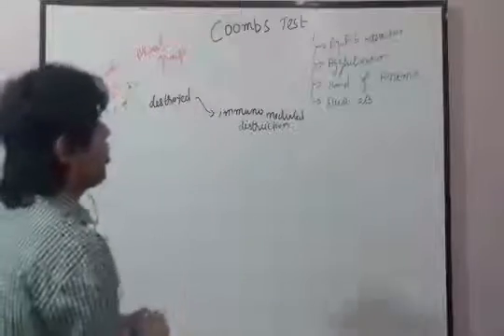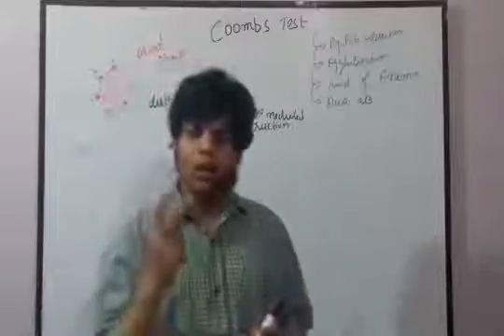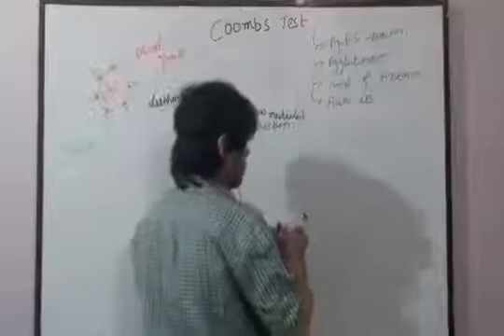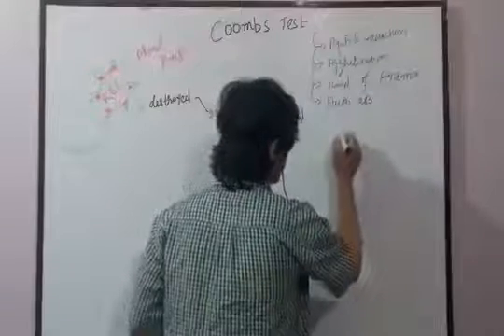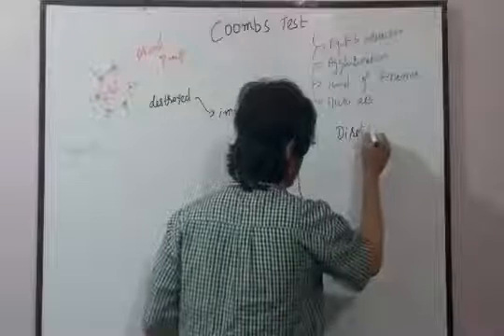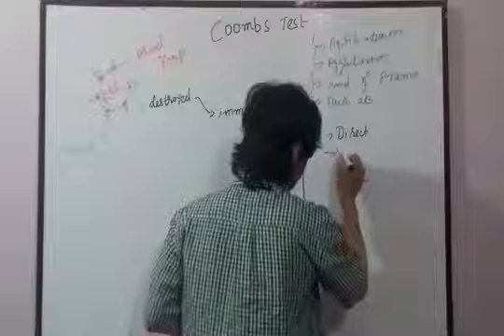Now let's talk about the Coombs test. There are two types of the Coombs test. Let me write here, two types. The first we call direct, and the second we call indirect.